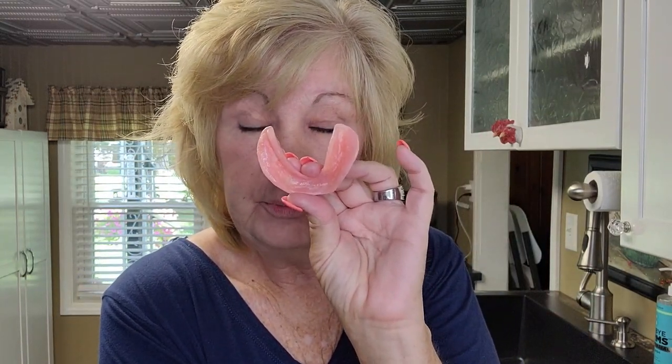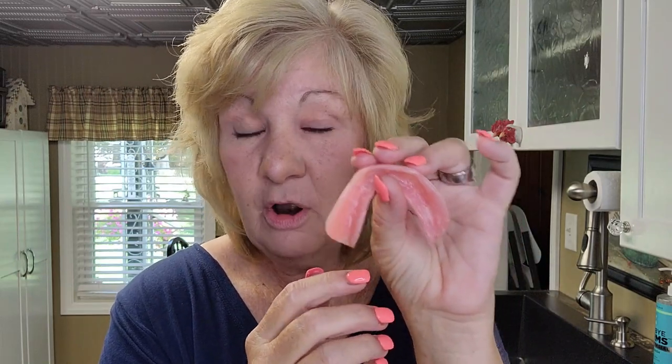If your denture doesn't fit you — if it's flopping around — it's going to be very hard. This one I can put in dry and it just sits on my gums; sometimes I don't even need adhesive. But if your denture is huge, whether it's your immediate denture or one you've had for a long time, you need to do a soft reline. It needs to fit you well. You can go to your dentist for a soft or hard reline, or there are at-home kits you can do yourself.